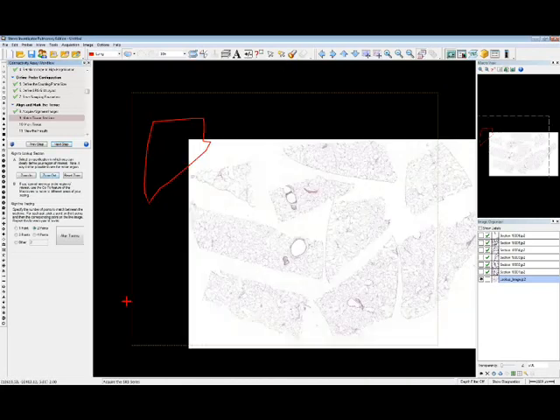I'm going to go ahead and zoom out again, and you will see where our previous tracing was, we need to line this up now with the new image or new section we're going to look at. You can line things up using multiple points. You can do 2 points, 3 points, or as many points as you like for alignment. I can select 3, for instance, and for aligning and tracing, I could say this point on the structure should be lining up with this point on the image. And I'll do the same for 2 more points.